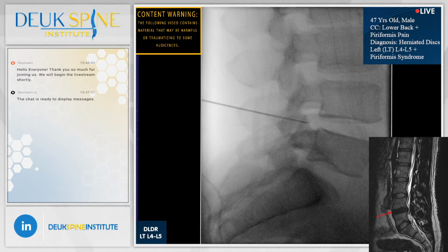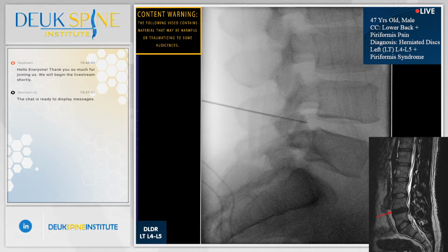I can feel the herniation. It's right there. See the tip of the needle? Jordan, show us the tip. Henry, you see the tip? Yes, we do. Right there. Okay, the herniation is all the way there. It's a big mushroom. All right, let's go AP, verify, and then we're going to put the needle in. We're going to do a discogram, and we're going to do his surgery.